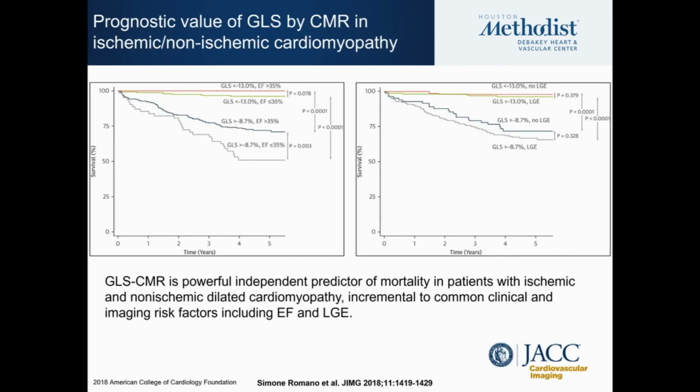Feature tracking global longitudinal strain has also proven to be prognostically useful despite LV ejection fraction, and more importantly, despite LGE, even in those who have it.